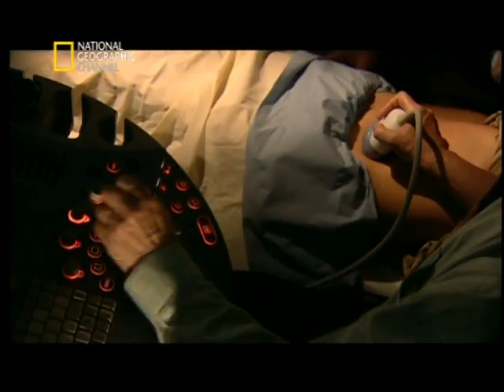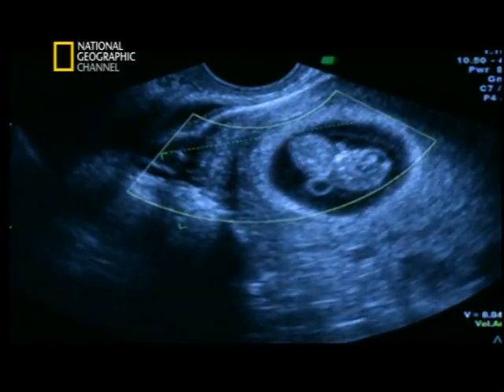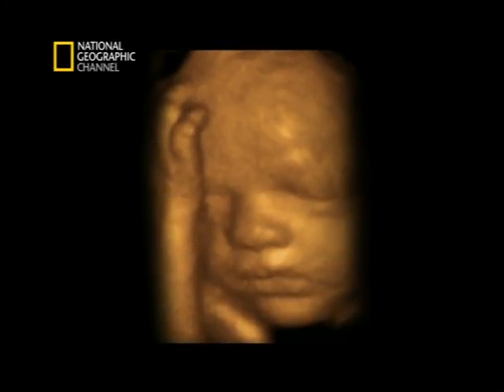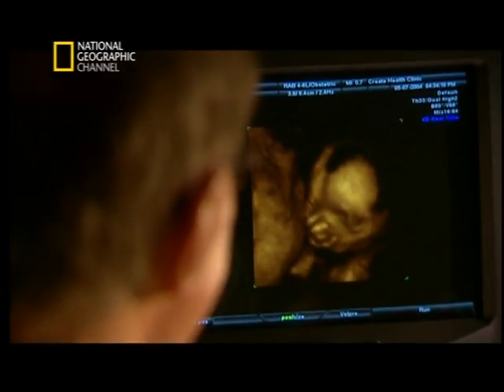Until recently, non-invasive research into the development of the human fetus has been restricted to analysis of stillborn specimens, or what can be gleaned from grainy, two-dimensional ultrasound scans. But now, this area of exploration has been revolutionized with the development of three-dimensional scans, and even more remarkably, 3D scans which move in real time, known as 4D scans.